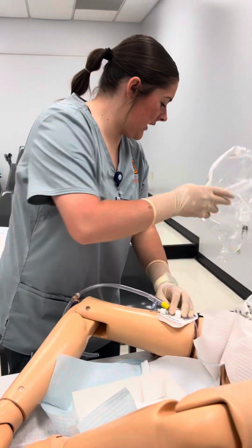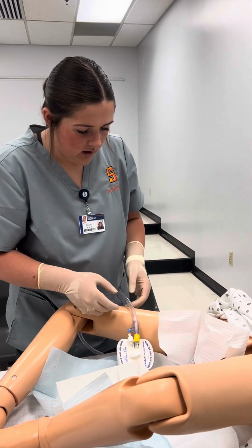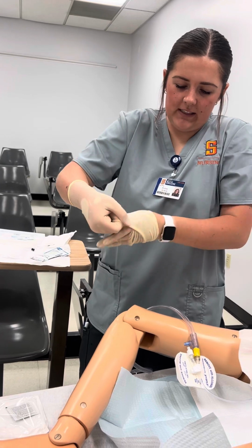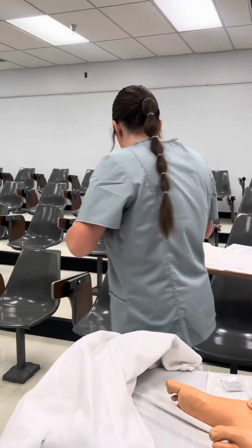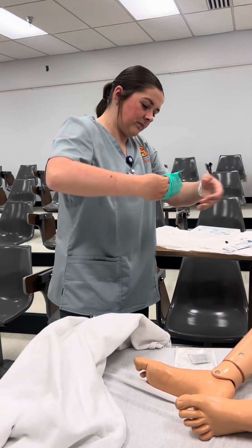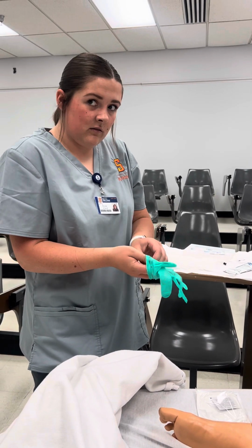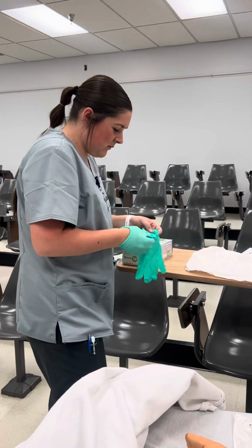The next thing I'm gonna do is I'm just gonna clean up my area. Let's see here. It would be stuck to the leg and it would not have this problem, but we're not gonna do that today on a mannequin. I'm gonna take off my gloves because I might have used some cleaner with iodine and I do not want to get iodine all over, so I'm gonna put on some different gloves and clean up my area. Maybe I can get my gloves on. Hands are a little bit sweaty.